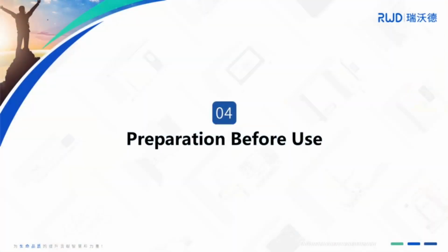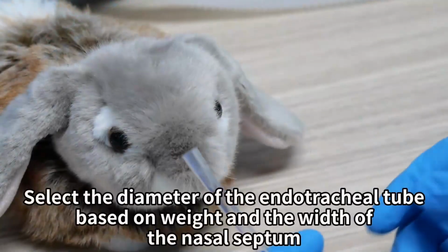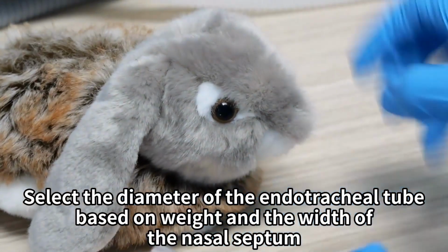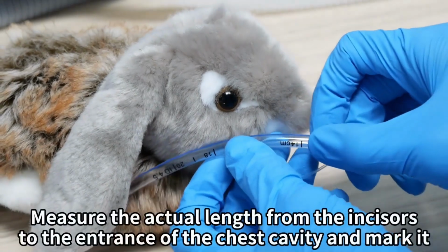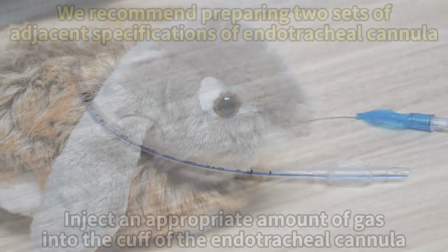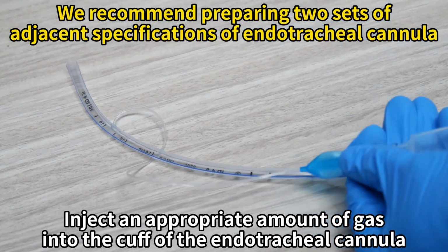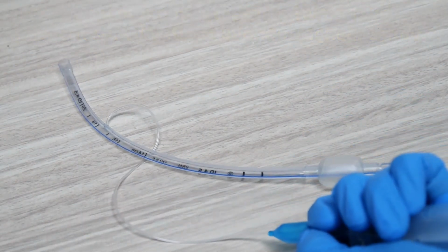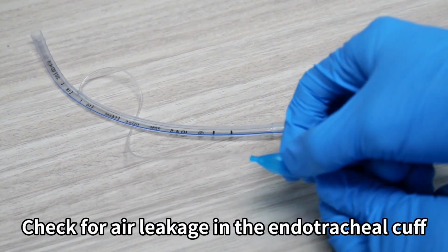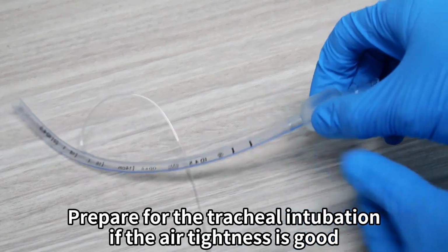Preparation before use. Please check the video for animal preoperative preparation. Select the diameter of the endotracheal tube based on weight and the width of the nasal septum. Measure the actual length from the incisors to the entrance of the chest cavity and mark it. Inject an appropriate amount of gas into the cuff of the endotracheal cannula. Check for air leakage in the endotracheal cuff. Prepare for the tracheal intubation if the air tightness is good.